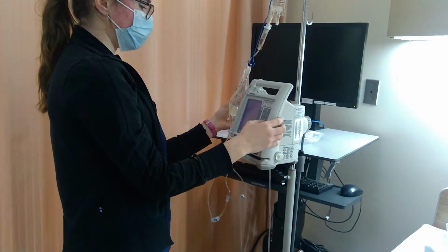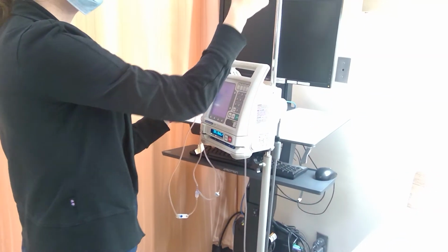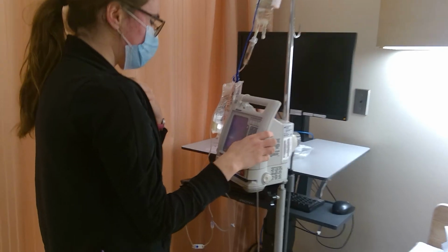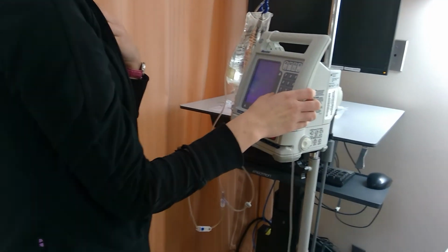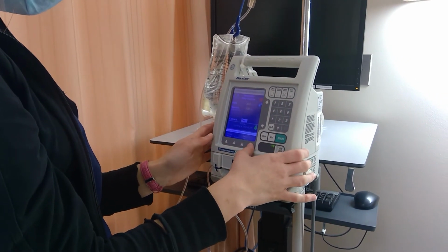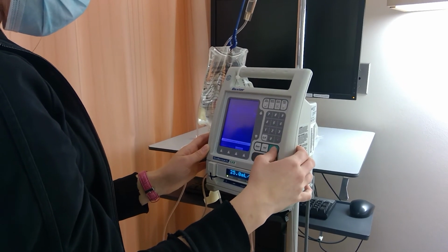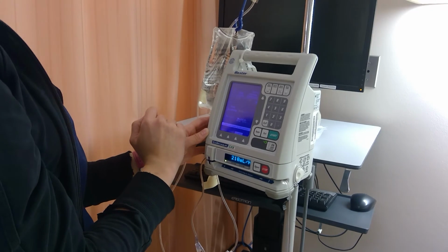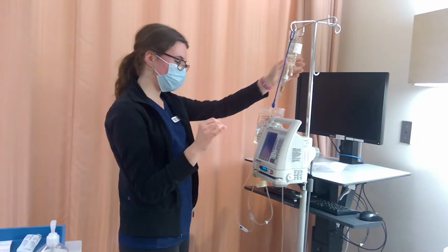I want my rate to be 210 because there's 105 milliliters in here, and we're giving it over half an hour, so you just multiply that by two to get 210. And so the volume to be infused is 105. I do want to call back, and I'm going to confirm my secondary. Yep. And now I'm going to start. So I see it's running at 210 with 105 in there because of that reconstituting. We added 5 milliliters to the 105 bag.